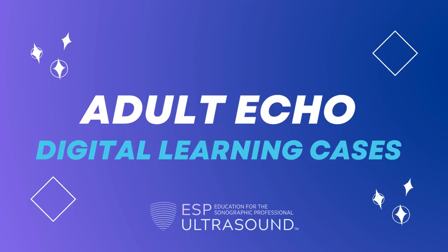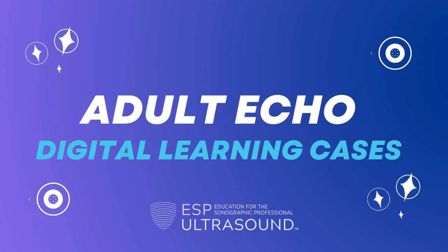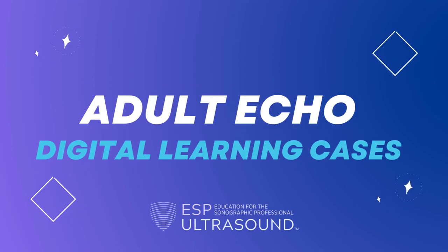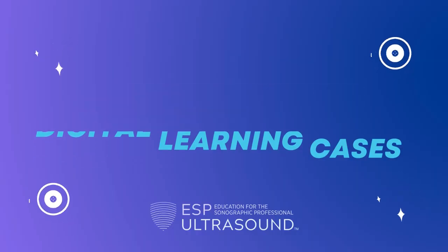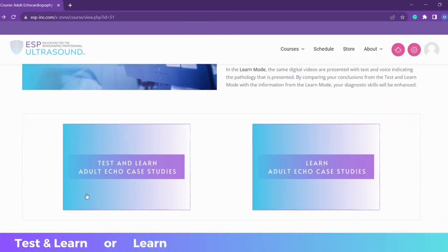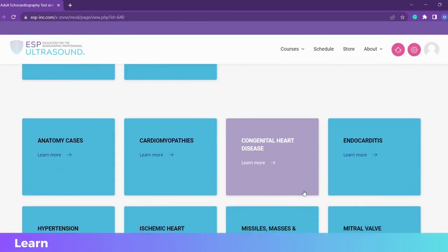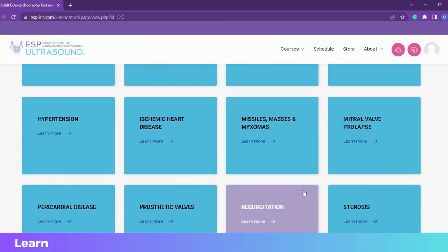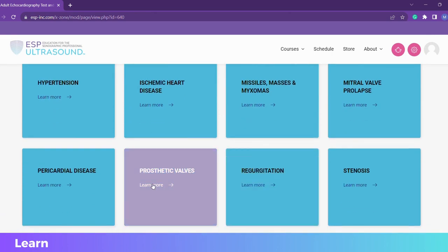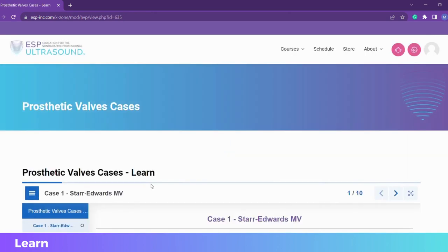ESP Ultrasound proudly presents our adult ECHO digital learning cases. There are two ways to learn. Click on 'Learn' to listen to our expert narrate the video clip.